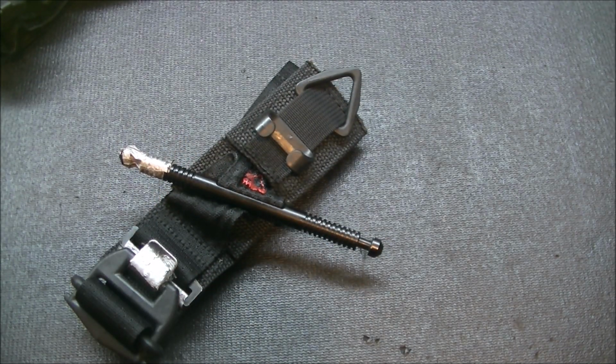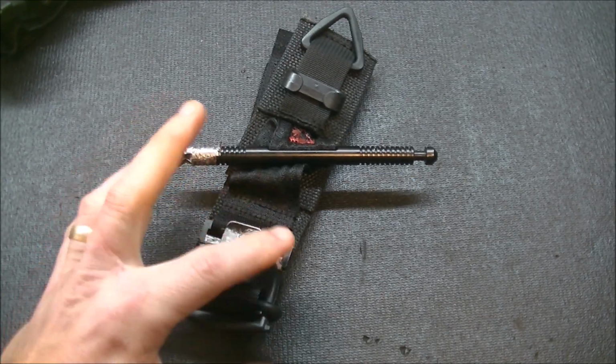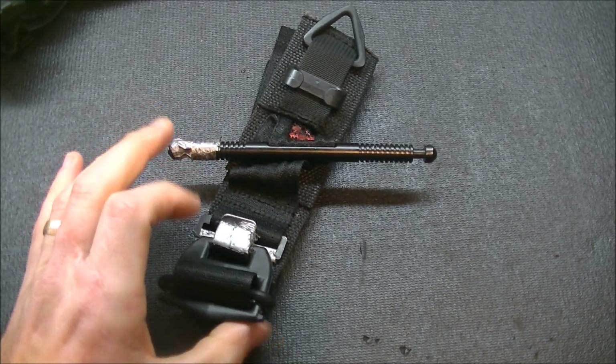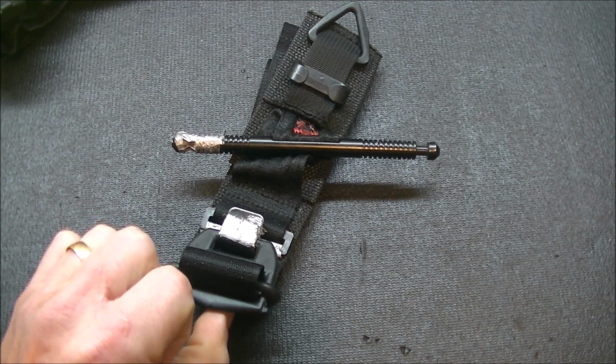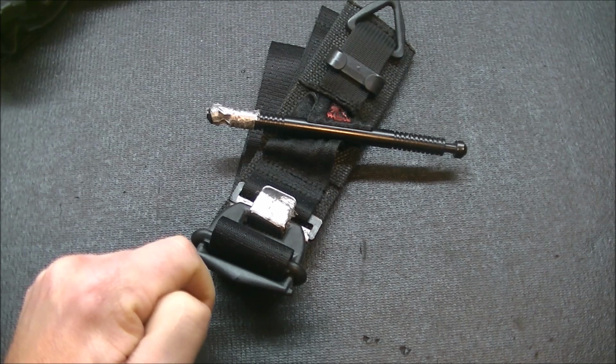Alright, so let's start with pros. The SOFTT-W has no Velcro and no real snag risk. Once you tighten this down, the only way you would be able to loosen it up would be if you were to intentionally push this piece up once it was tightened down. And it would actually take a good bit of effort.